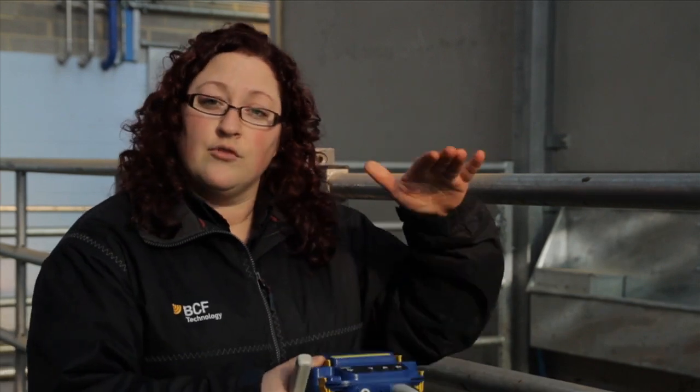Another feature that you can change is going to be the depth. Again, if you're looking at things that are in a very superficial field, or things very near to the surface of the probe, such as an early pregnancy or the ovary, you would have the depth at a more superficial setting, so you wouldn't be looking as deep. If you're looking at things that are further down within the cow, such as a late-term pregnancy, then you would need to have the depth set at a greater number of centimeters.